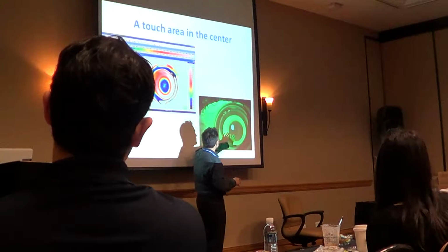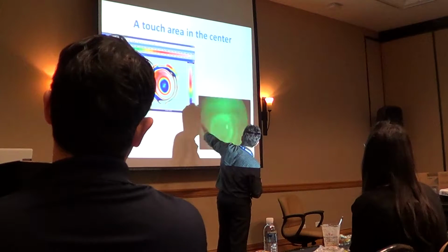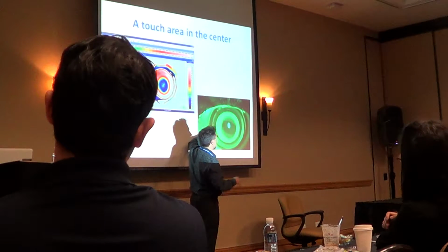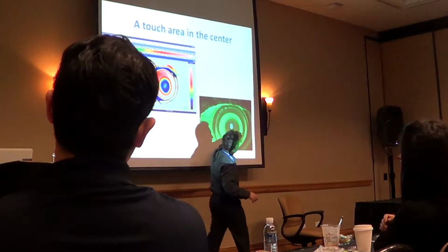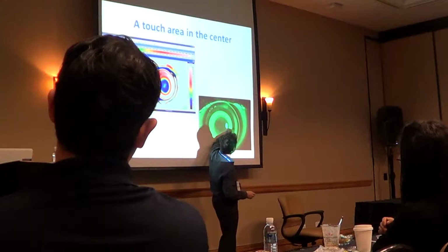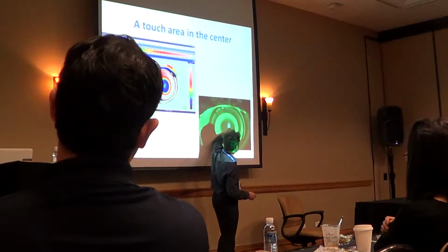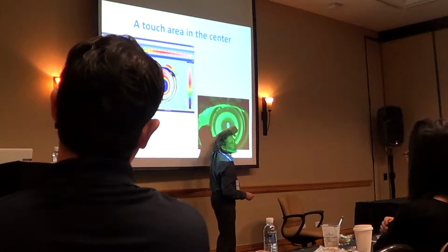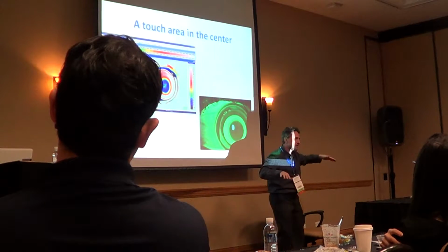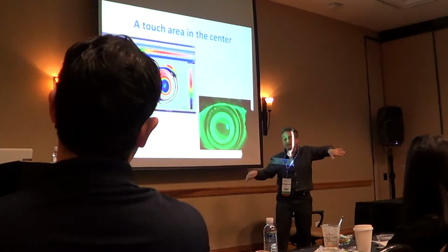The lens is rocking to the, I guess it's left eye. This one. Yeah, left eye. So it's moving to the nasal, and you could see more or less a little bit steep here, but in the temporal you could see that it's flat because the inner zone, the inner ring is strong and the outer ring. So it's clear that you have more pressure in this zone, either the reverse curve and the edge. So you have the lens that is moving to the nasal, tilting, and creating this lift.